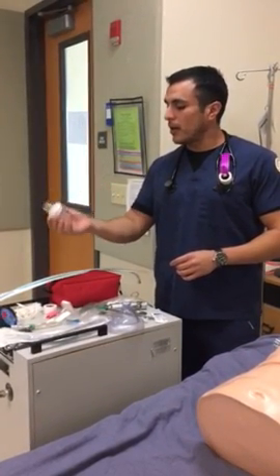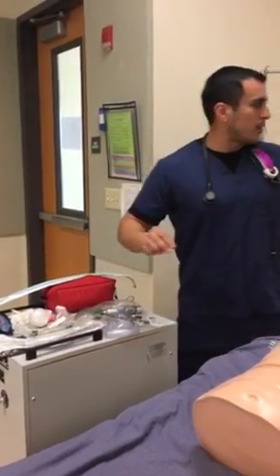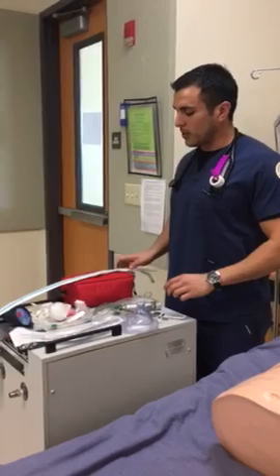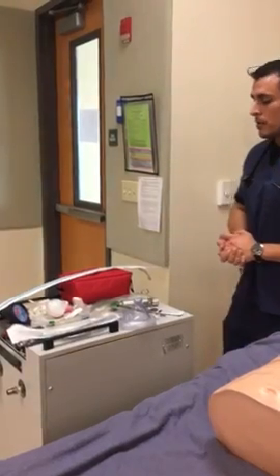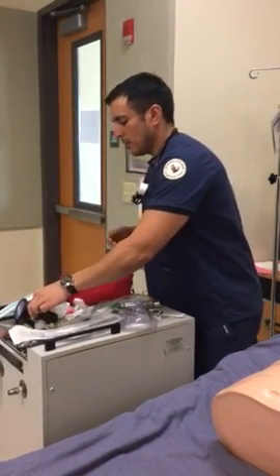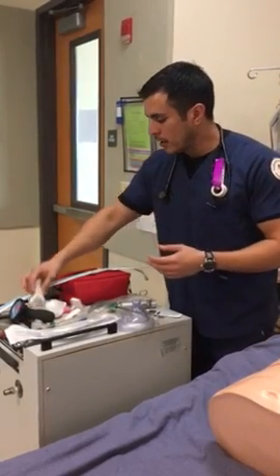We'll also need a humidity source. This is an HME. In other situations, we could be using heated humidity. We're going to have suction also. Right here we have our inline suction, but we also have our Yankauer set up over here. We're going to have lube, forceps, and a bougie just in case it's a difficult airway. And I think that's pretty much it for that. We also have a manometer so that we can actually check the number of the pressure. And we also have gauze for the corners of the mouth, so that they don't get any sores if we're using, say, a tie.